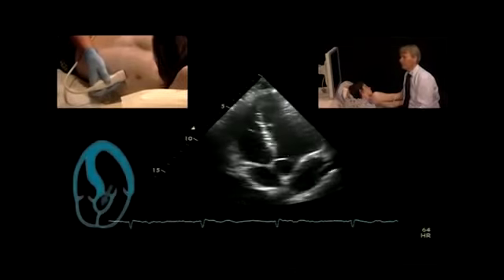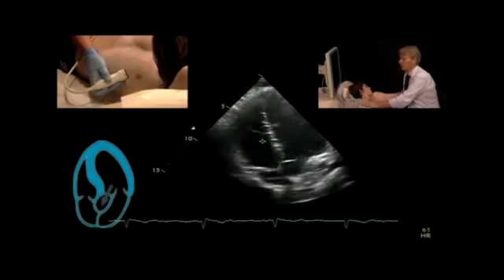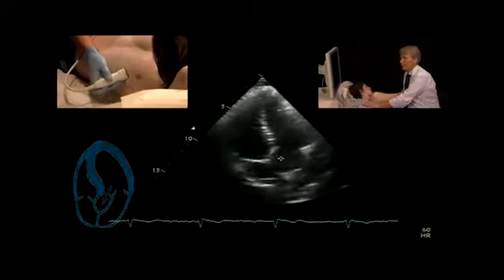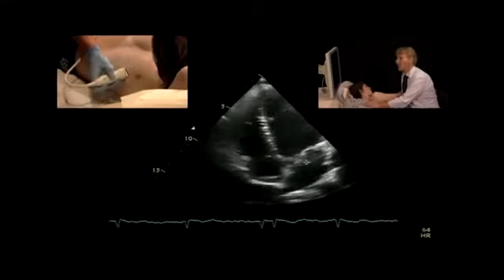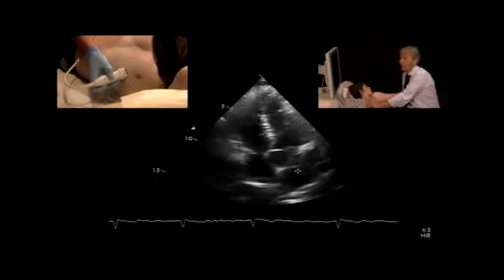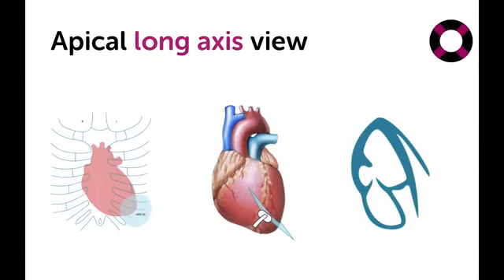What do you see in the 5-chamber view? You see the LVOT and the aortic valve. You don't see the mitral valve as well anymore. The left atrium is not in its maximal dimension, so it's also no view where you would really look at the left atrium.